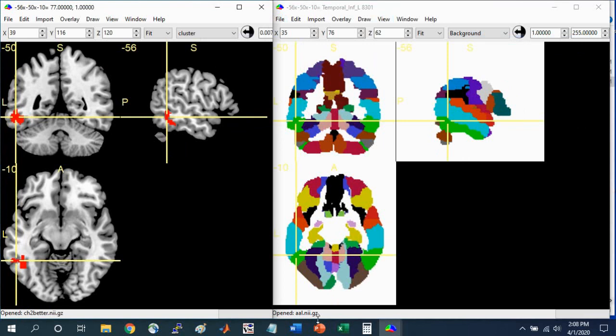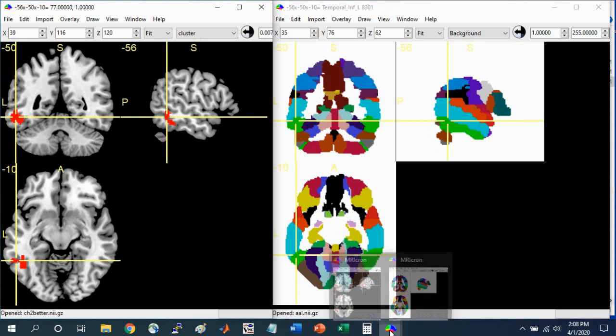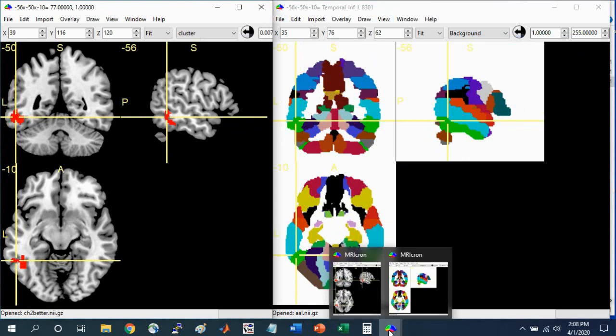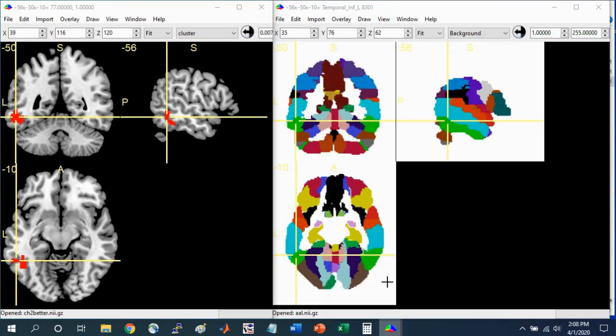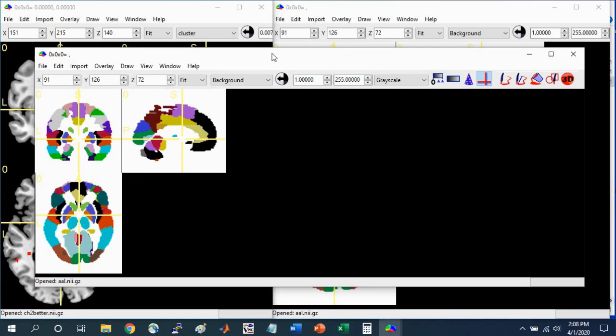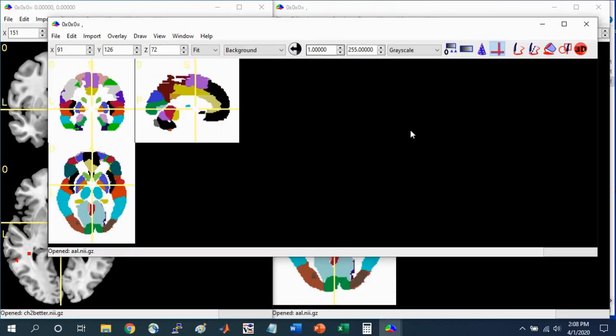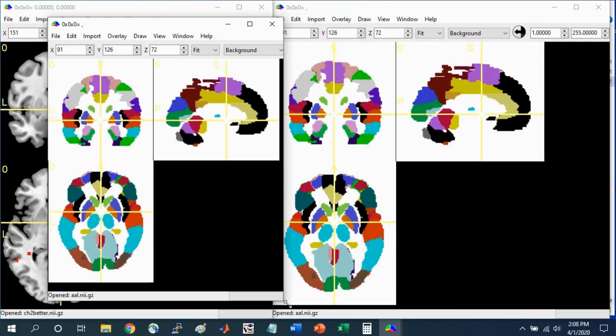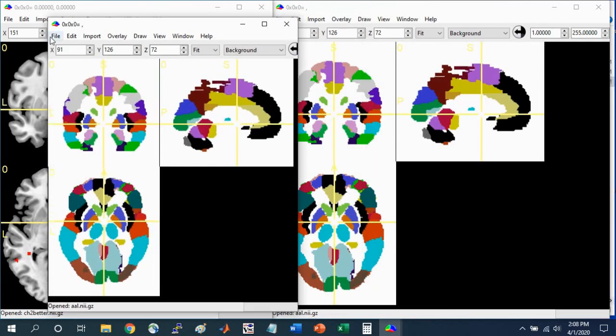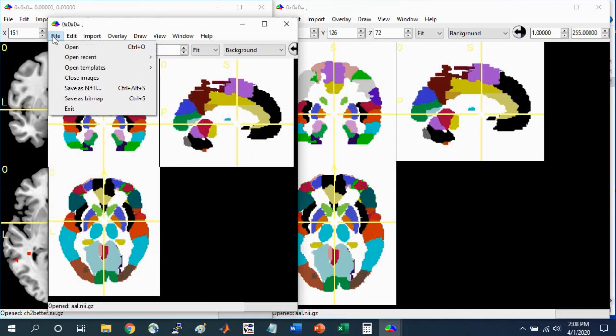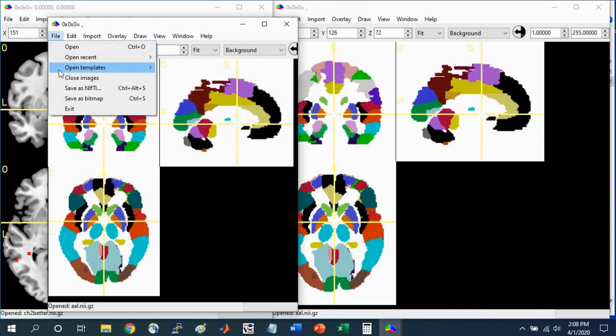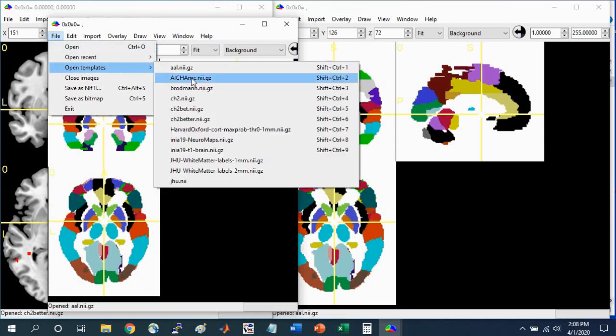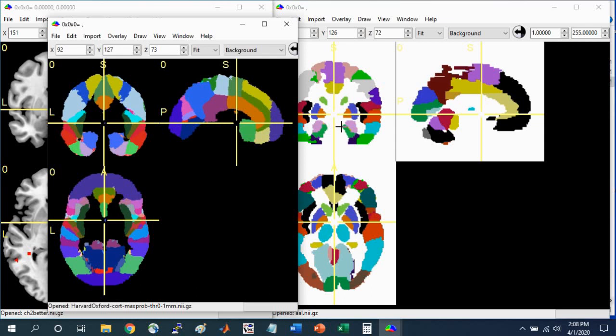Another thing to keep in mind is you can open additional windows. If I want to right-click and go to MRI-Cron again, you can have two atlases open. If I want to open the Harvard-Oxford Atlas as well, you can have both of these open at the same time.